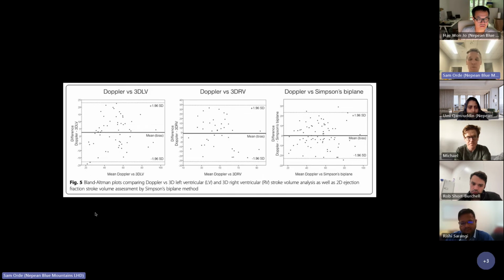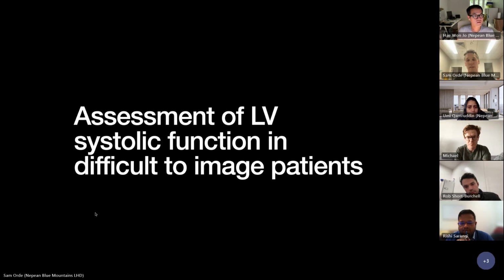So the conclusion we said is that it's not great in the critically ill. I think what we'd love to do maybe is to try and look back at the question that Emma had, which is how good is it at estimating LV end-diastolic volumes? And I think we'll need to try and figure out better ways of looking at the LV to determine that, such as with CMR or something. Okay. Any questions so far? Happy with that, with the ejection fraction so far?